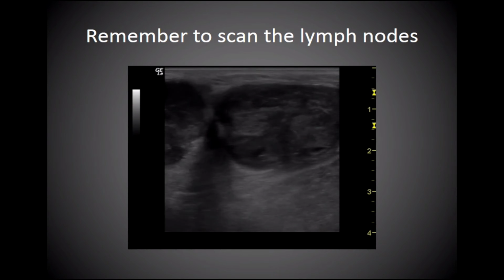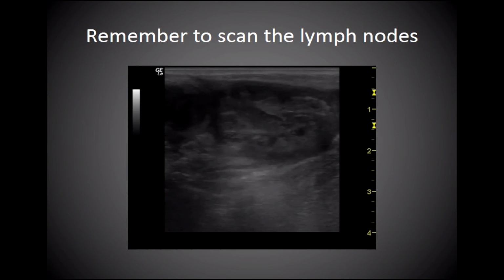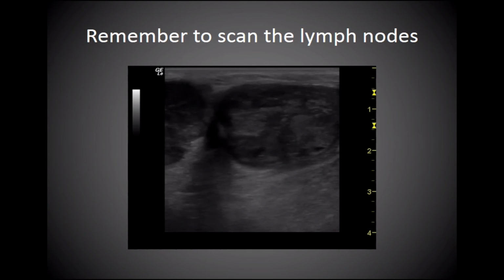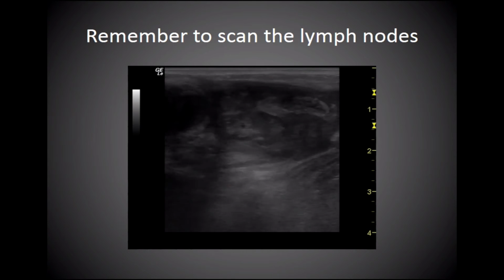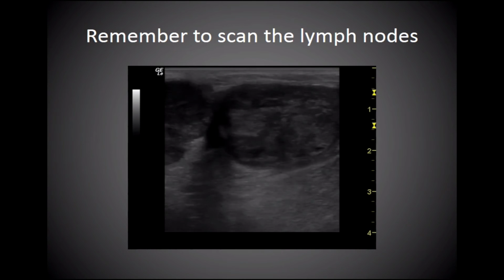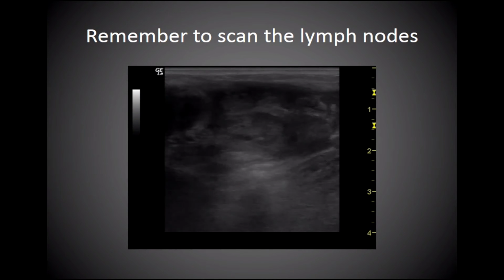Your evaluation is not complete unless you scan the lymph nodes bilaterally in the neck. If you're unfamiliar with the ultrasound appearance of benign versus hyperplastic versus malignant lymph nodes, be sure to watch the video lecture in this series on lymph nodes first.